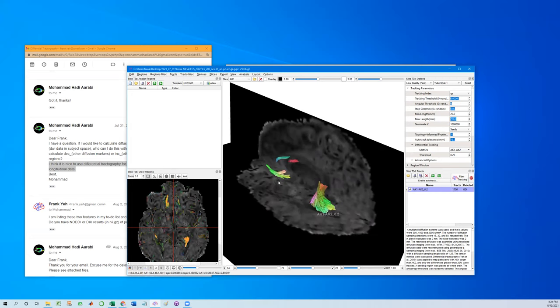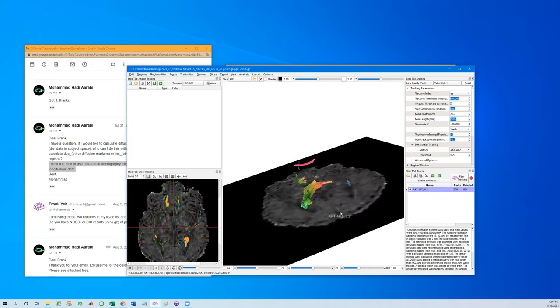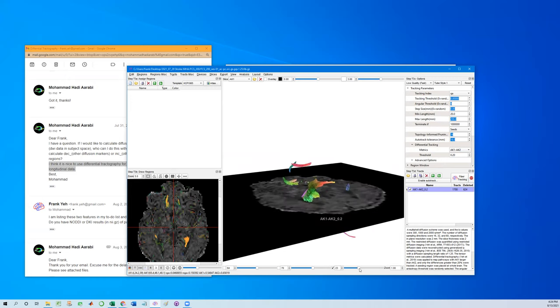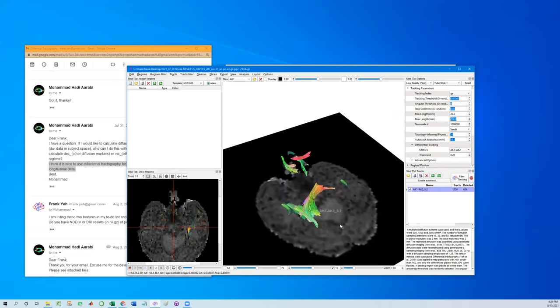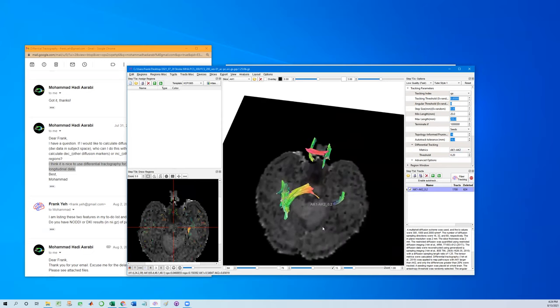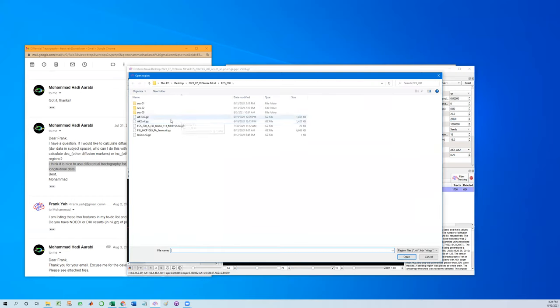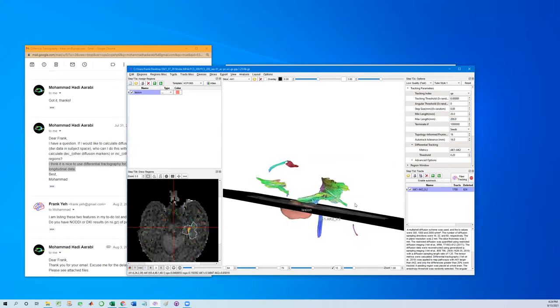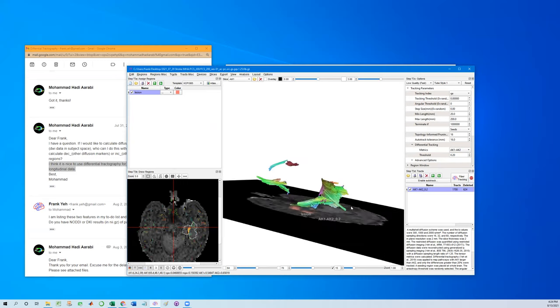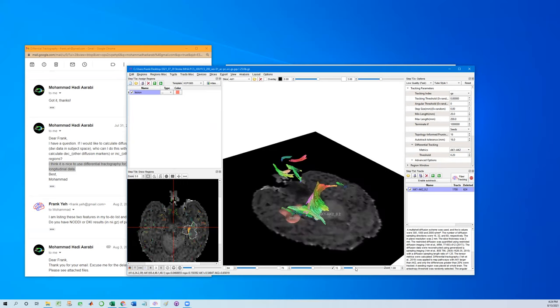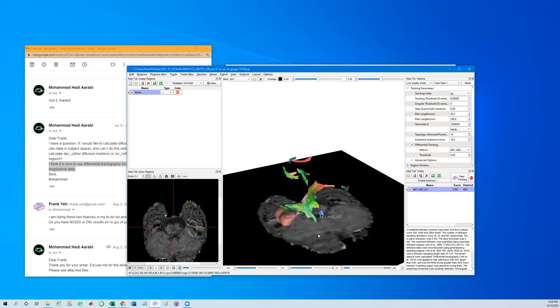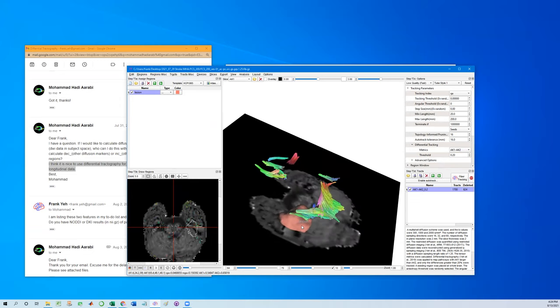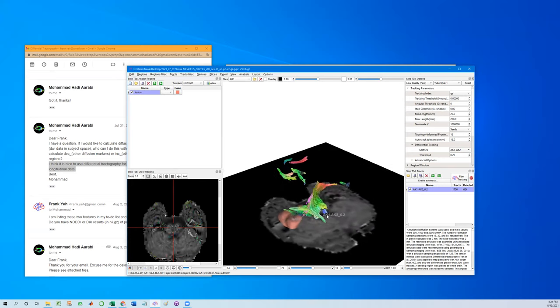So as you can see here, it shows tracks with axial kurtosis which decreased more than 20% between these two scans. Here I load the lesion to show the relative location. So you can see it nicely matches the lesion location of the stroke patient. And this shows the pathway that has more than 20% decrease in axial kurtosis.